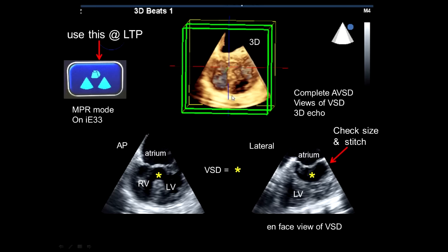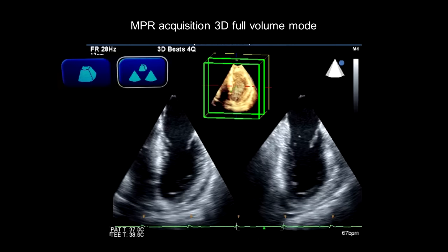When you're doing 3D full volumes, you should always use the 3-panel MPR display during acquisition. Make sure you see the green box to confirm you're doing a full 3D full volume acquisition. There's also a button for the 3D-only display that you can toggle between as needed. For example, with the LV and mitral valve, you want to make sure the entire mitral valve annulus and the entire LV are included in both panels with no stitch artifact. Use the three-panel MPR mode during acquisition, and the 3D-only display when reviewing.